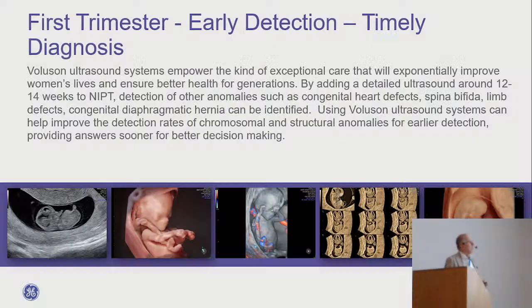So it's really nicely done. And you can see, I think you know all the technologies now. So how do you call this technique? You will not get your certificate if I don't get an answer. This one. Yes. You write down, okay? That's good, perfect. Yeah, that's very well done. And do you remember how this rendering mode is called? How nicely HD Live. Yeah, Roland, thank you very much. So it's HD Live. So that works very nicely in the early pregnancy.